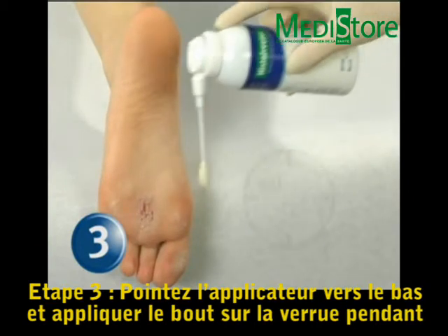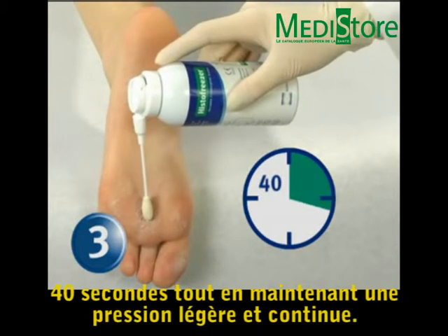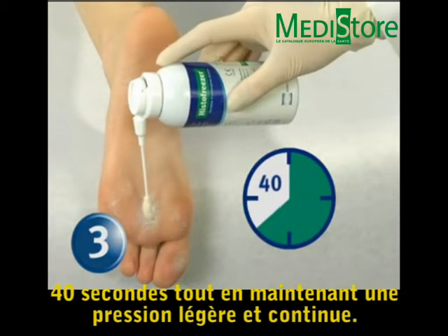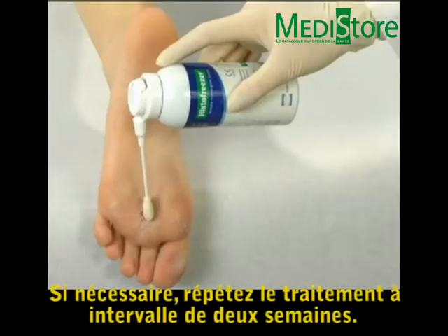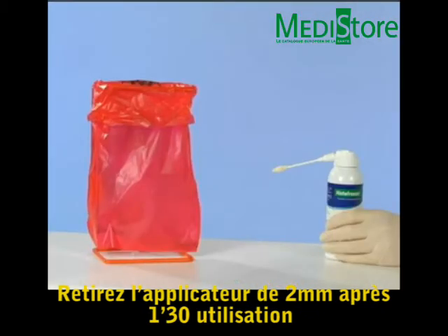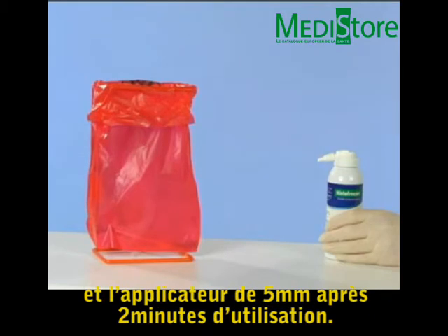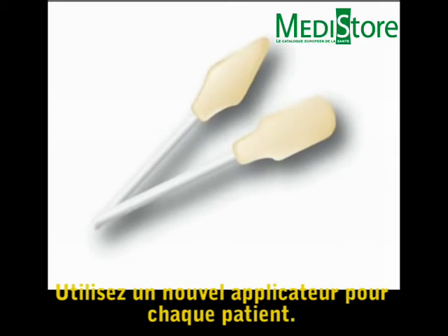Step 3: Point the HistoFreezer applicator straight downward and apply the tip to the wart for 40 seconds using a slight and continuous pressure. If necessary, repeat the treatment at 2-week intervals to reach resolution. Discard the 2 mm applicator after 1½ minutes of use and the 5 mm applicator after 2 minutes of use. Use a new applicator for each patient.